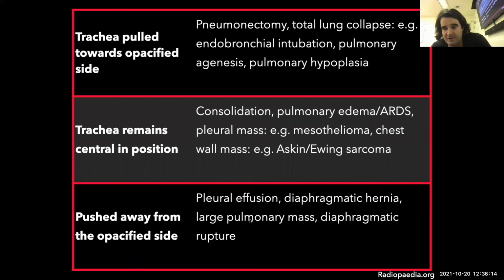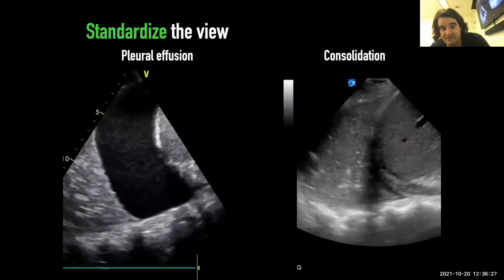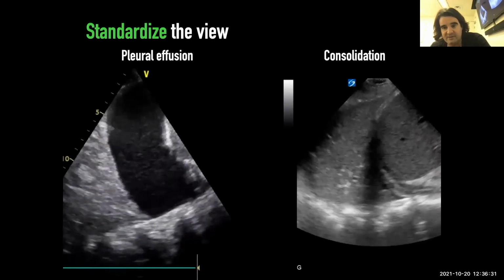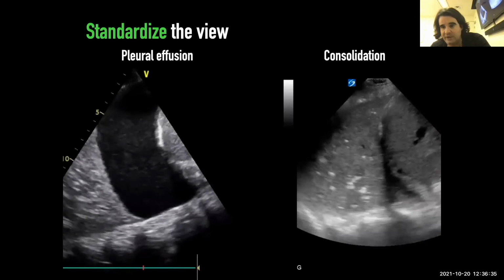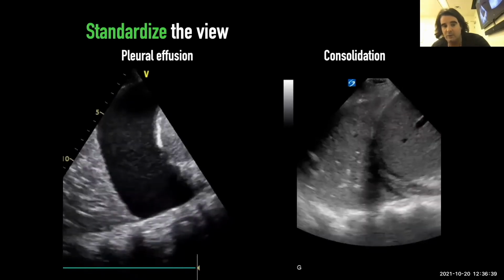I don't think these are used to look at an X-ray, but clinically I'm very cautious. I do look at this, but I am very cautious to make sure that I don't jump to a conclusion, because what I would like to do, ideally in most patients, is debias myself, is to think, the X-ray suggests this, but let's just make sure it's not something else, or let's make sure we rule out an effusion or a consolidation or a raised diaphragm or blood or what have you.